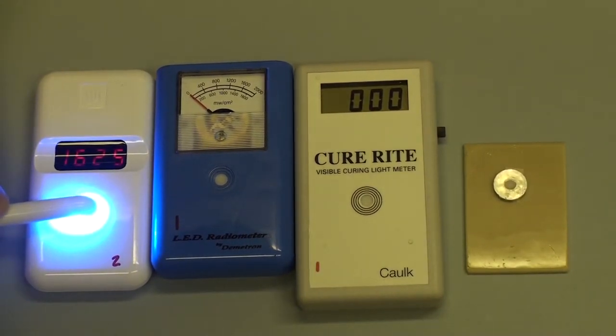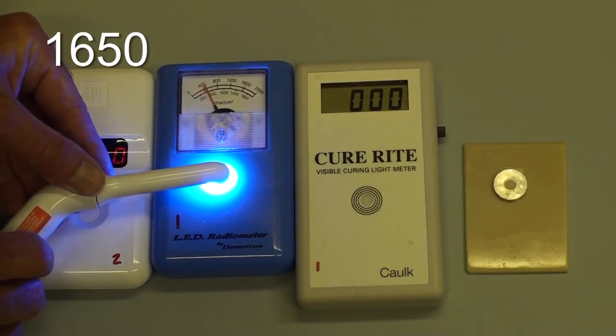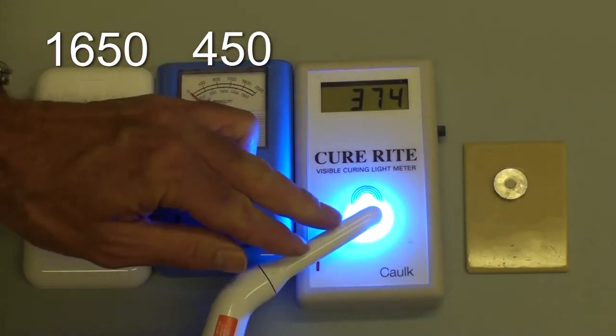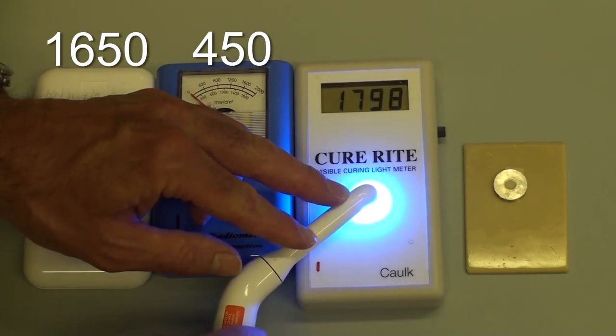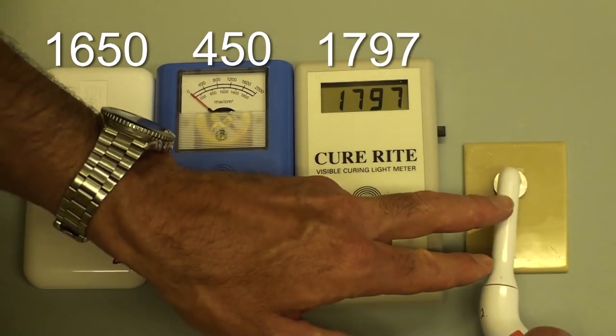We'll now look at another curing light used on the same radiometers. We see here again there's quite a range in the irradiance recorded using the three different radiometers. So again the question will be: how much irradiance was actually delivered to the specimen?